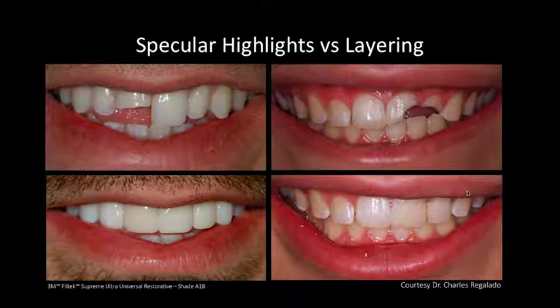First, the one central incisor was treated, and then the patient elected to have the right lateral incisor, and the left central, left lateral, and left cuspid all treated as well with the same technique. This was done with an injection overmolding technique using one color of composite.